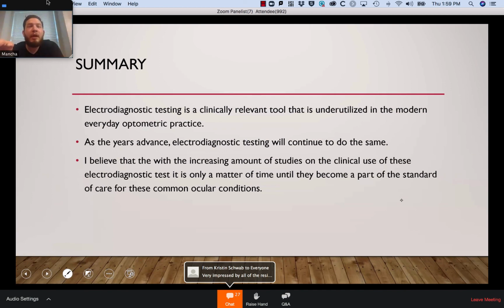But this reminds me, I had a professor tell me, 4 or 5 years ago, we weren't really using the ganglion cell complex to say if this is glaucoma or not. Not until there's enough research to say, okay, now we know that there are structural changes being seen in these ganglion cell hemifields, superior and inferior. They're going to correlate with these visual field dysfunctions, right? And so those all make sense. And so in my head, I'm thinking, why are these electrodiagnostic tests not being used to pick up these earlier changes in function of those retinal ganglion cells, or just throughout the whole retina in general?